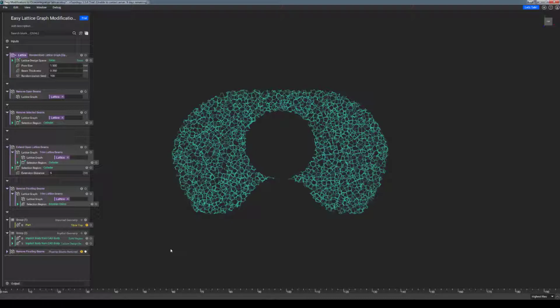Obviously, what I've shown here today is not intended as a be-all, end-all solution when it comes to designing or modifying your osseointegrative lattices for your medical devices. There are many ways to go about this within nTopology, and this is merely an example on how to use our pre-existing osseointegrative structures toolkit to hit the ground running with nTopology.